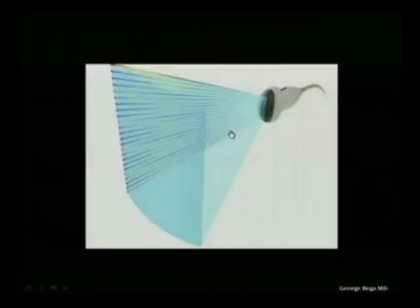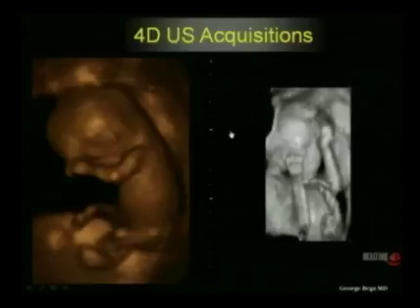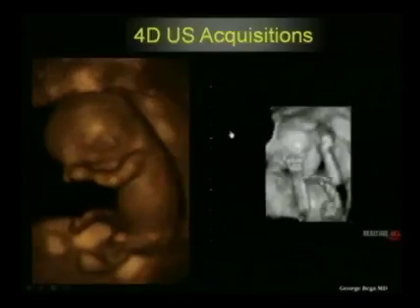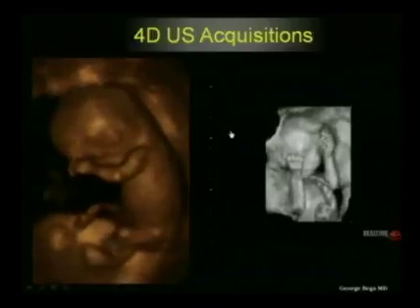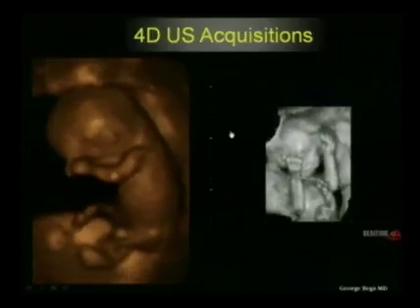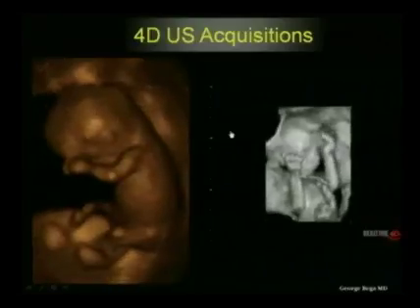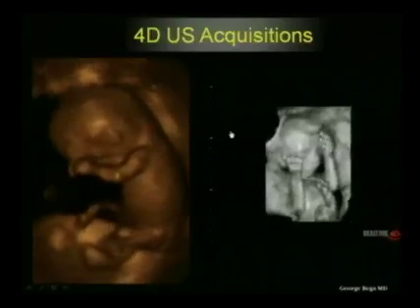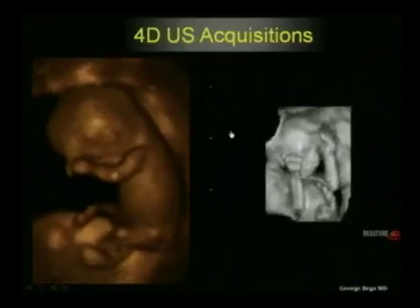We would not ideally use this as our default acquisition mode. We would only reserve this for moving targets. And here are two examples of this. On the left, you see a 10-weeker. The acquisition is not too fast, but it is fast enough to actually keep up with the slight motions of this fetus this early. The fetus on the right is a 12-weeker, and there are some very fine small movements of the hands that you would appreciate by having this acquisition, which is not really that fast, around 5 volumes per second.